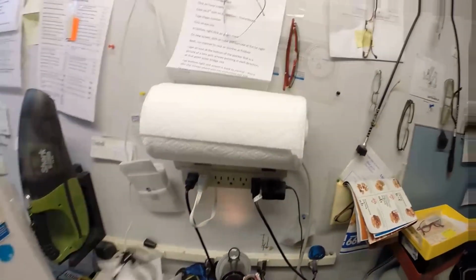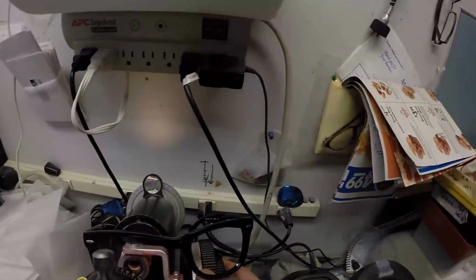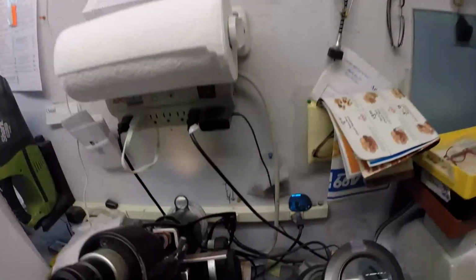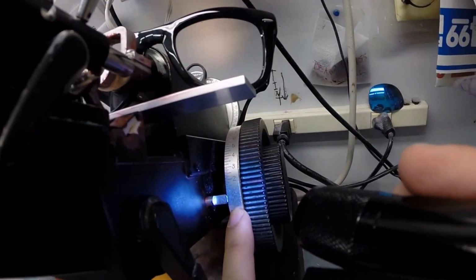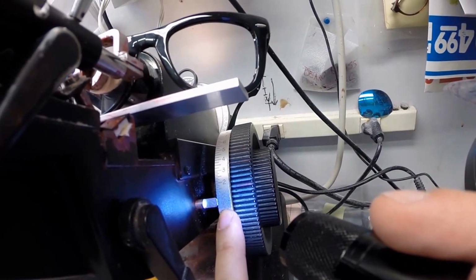I'm going to come down here to my Marco 101 lensometer, my very dusty and trustworthy one. I'm going to put that in over the optical center, and when I read the power of the lens, I'm reading plus 50, which is exactly halfway between 0 and 1, which is where you would expect to find 0.50.